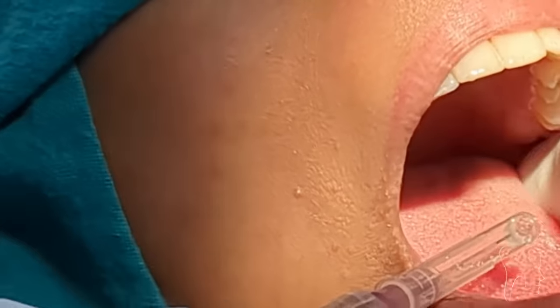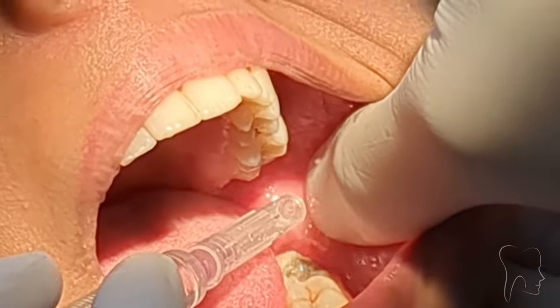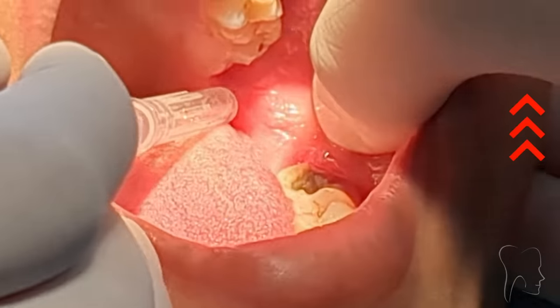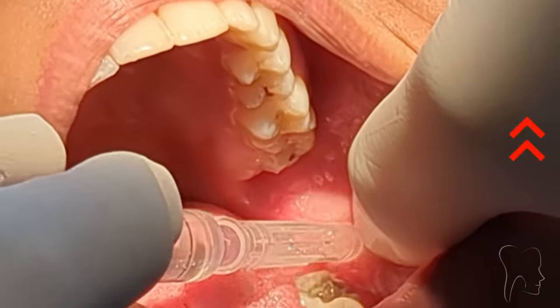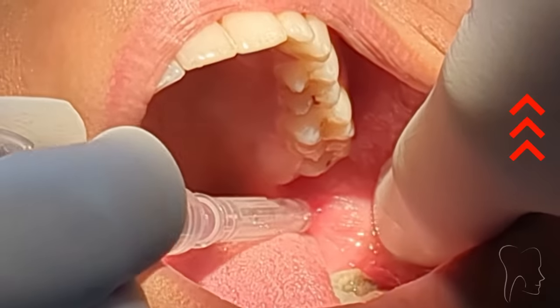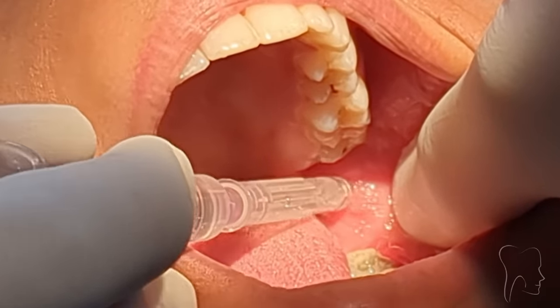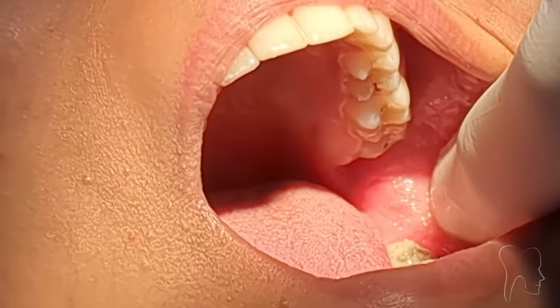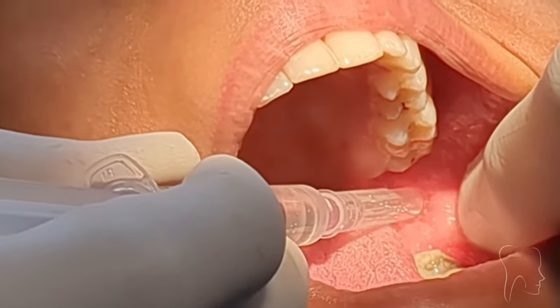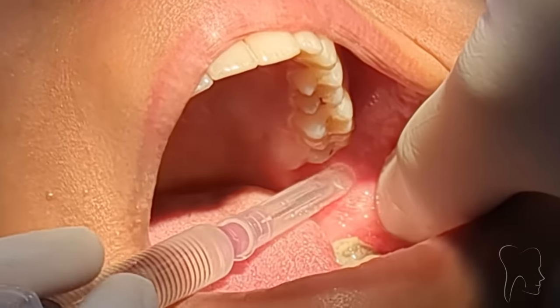To give a proper injection for the inferior alveolar nerve block, first you have to retract the tissue. This is the pterygomandibular raphe, this is the deepest portion of the anterior border of the ramus — that is the coronoid notch. So three-fourths distance from this, one-fourth distance from this. You just have to keep two things in mind: insert the needle at this point and keep the barrel of the syringe at the premolar region.